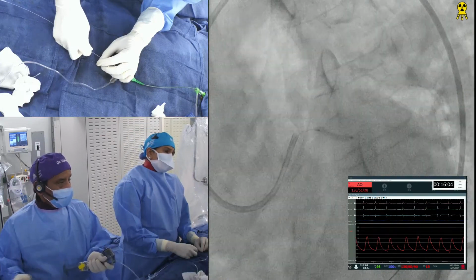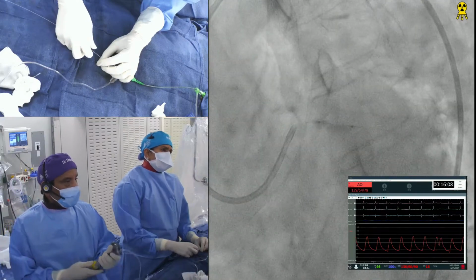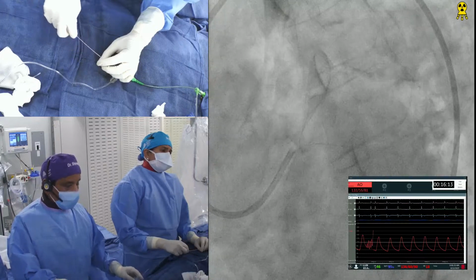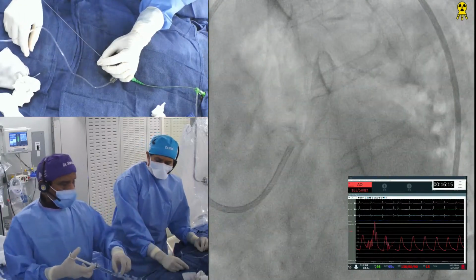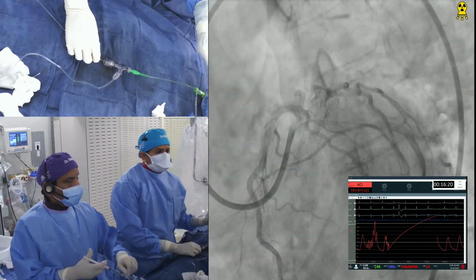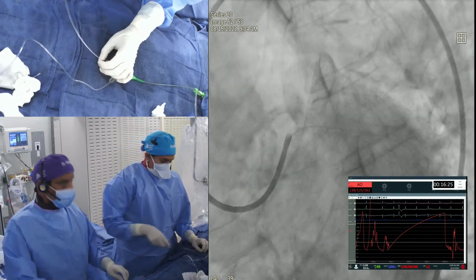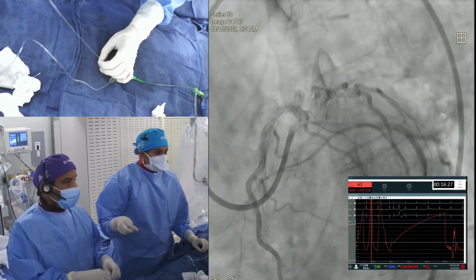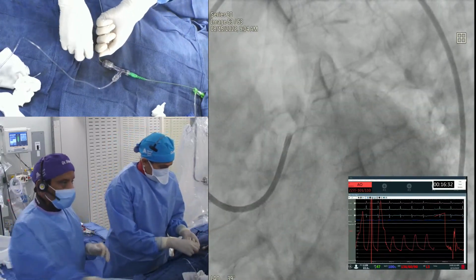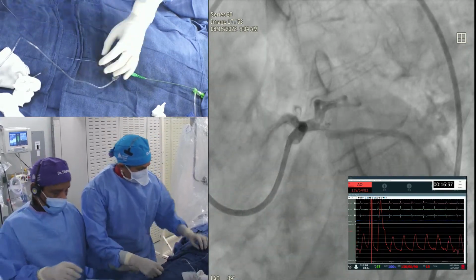I think we can do a stent directly. Okay, done. Promus, 3.5 by 16 Promus. Where was the Promus last time? Take a picture. 3.5 or 3.0? 12 or 16? Yes, 16, so you have to be after the 16. Fine. Looking excellent already.